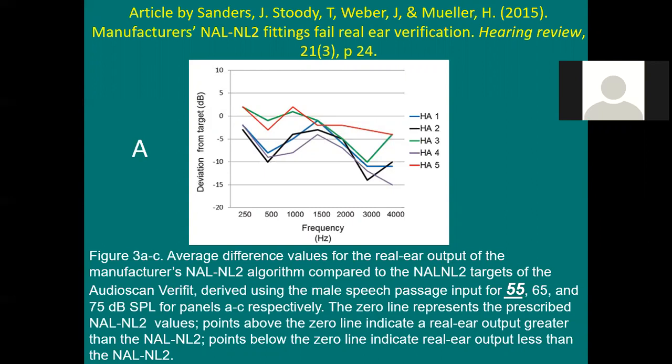Then you took that hearing aid off and put on Bernafon's hearing aid, programmed to the same hearing loss according to Bernafon's NAL2. Then you put the probe tube in my ear, did Real Ear, and you find out the black line. Whoa, I was way shy. I was close to the Real Ear's version of NAL2 in the mids. Still shy, but how much?